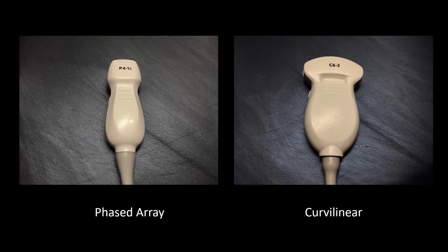Here's a slide depicting the probes that you might use. You can see the phased array probe on the left and the curvilinear probe on the right. Either of these probes are appropriate. The phased array probe does have a smaller footprint, so it's going to make imaging between the ribs easier, whereas the curvilinear may be more appropriate in patients with a larger body habitus.